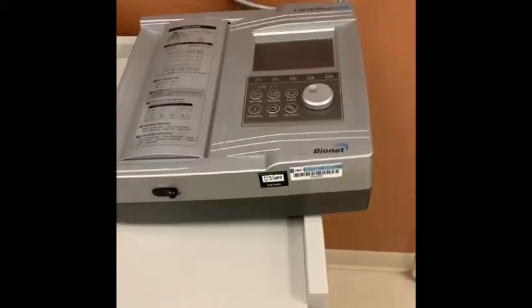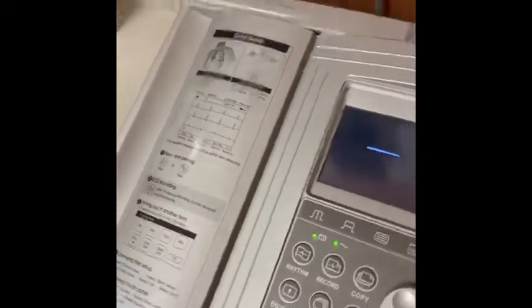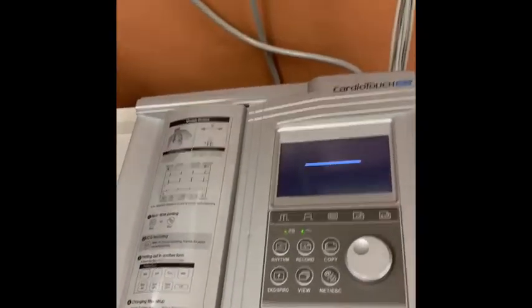So the first thing we're going to do is go over the EKG machine itself. Here is our EKG machine. We're going to turn it on from the back and then as we turn it on it's going to go ahead and give us a whole bunch of readings.